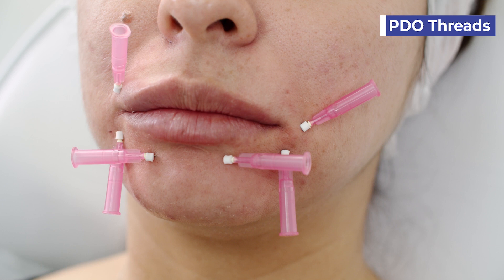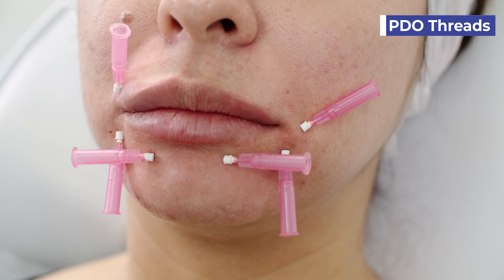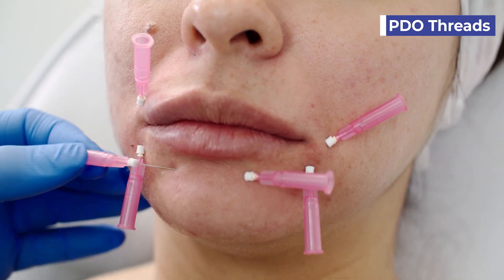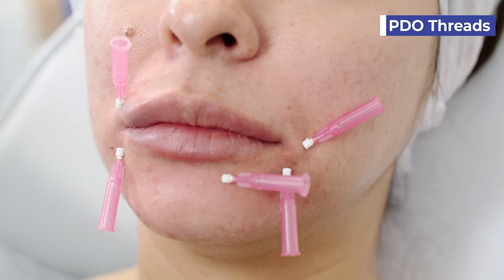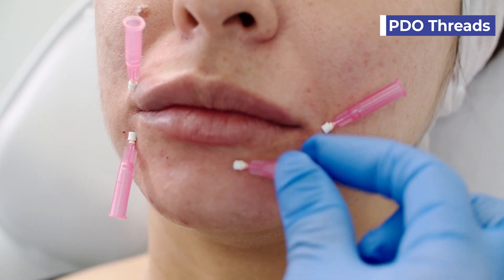It's all about architectural design. You can either cross-mesh the threads or place them in the areas where threads are needed in order to build collagen. The threads are delivered through needles — the needle deposits the thread, which builds collagen around the area. The actual insertion site is not going to be the precise location where collagen forms; it will be all along that area.